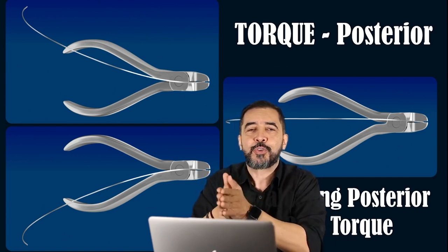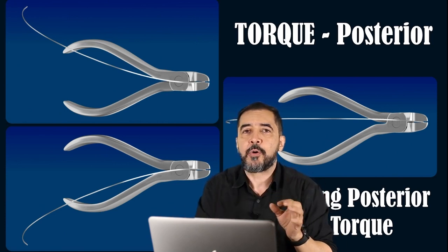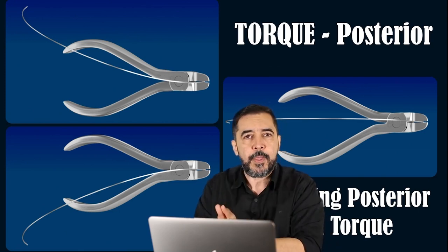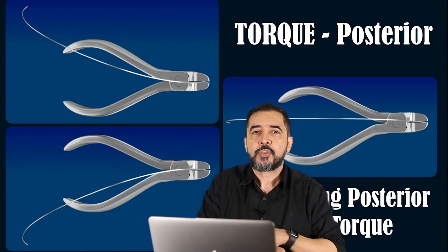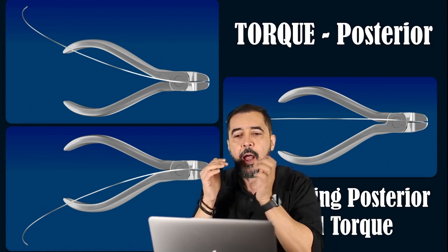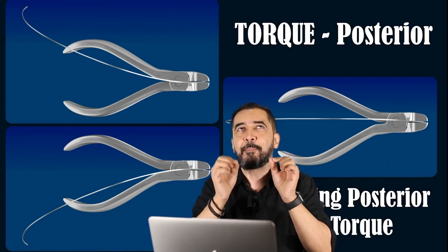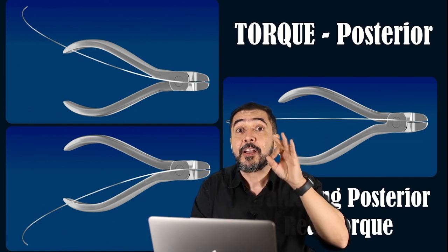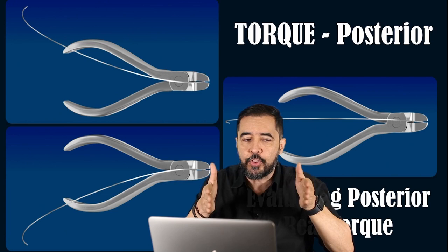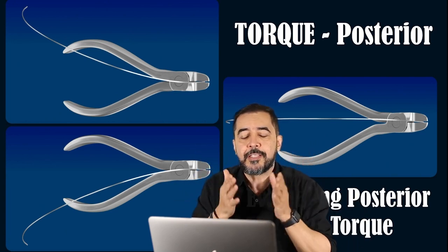And I told you before also that the signals, negative or positive, I'm representing here are related to the inclination of the crown. I know many people refer to the inclination of the root. So sometimes we say a positive relative crown torque, because it is what the tooth we are moving, or the group of teeth we are moving, will do.